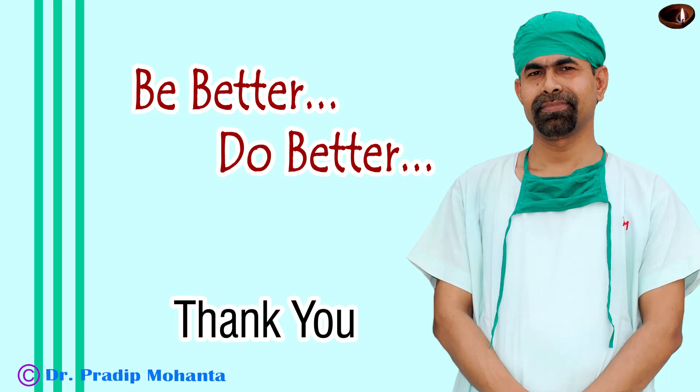Thank you very much for your attention. I hope this video will help you in developing your surgical skills. Whenever the cataract is soft, like grade 2 nuclear sclerosis, the pre-chopper is a nice instrument to help us. In such cases, you may not be able to hold the nucleus with vacuum, so the pre-chopper does a nice job. Be a great surgeon and serve your patients with love, respect, empathy, and great surgical competence.